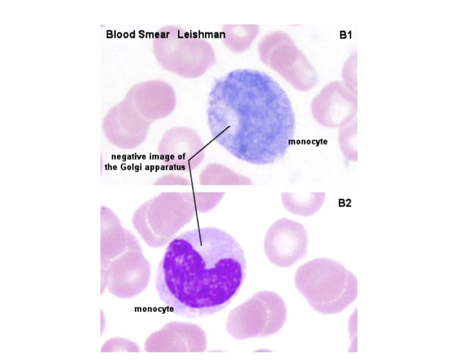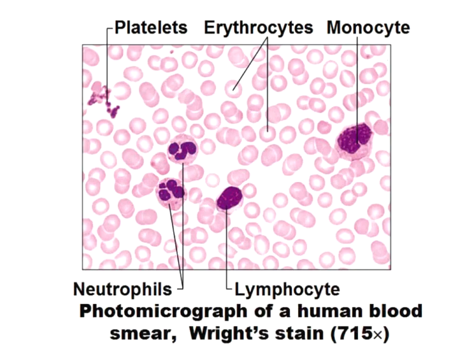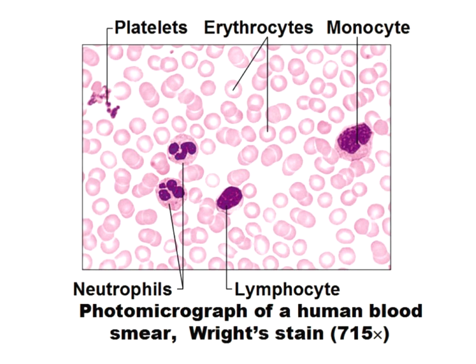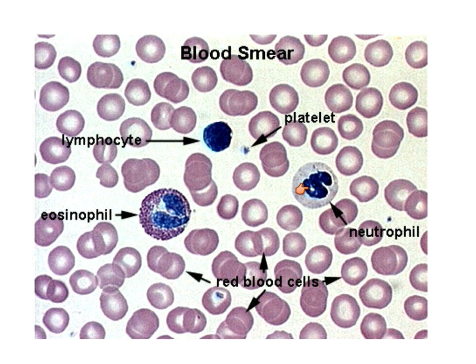Looking at the monocyte with that funky U bubble-shaped nucleus — kind of like a kidney bean or the bubble letter C. Then we have our neutrophils again. Platelets are just fragments. We have our lymphocyte here — very little cytoplasm, nice more spherical-shaped nucleus. Then we see the monocyte — look how big that cell is in comparison to everybody around it, the neutrophils, the lymphocytes. It's like Jupiter in comparison to the red blood cells, but it still has that characteristic kidney bean nucleus.